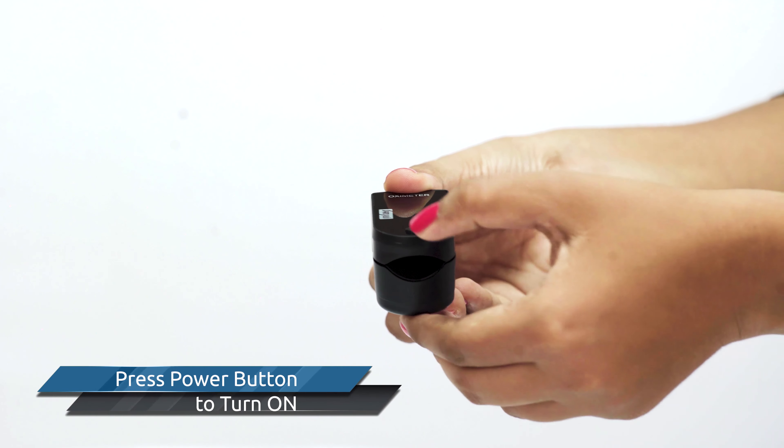Press the power button to turn on. Next, insert the finger into the rubber hole and then release the clamp to start the oximeter for blood oxygen detection.